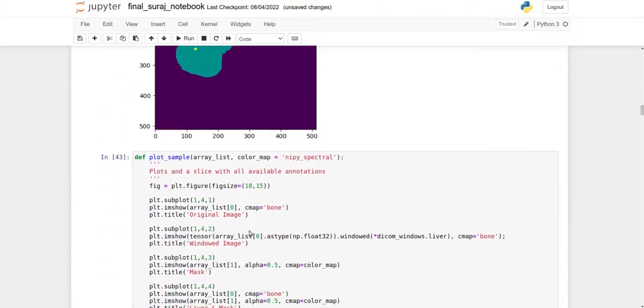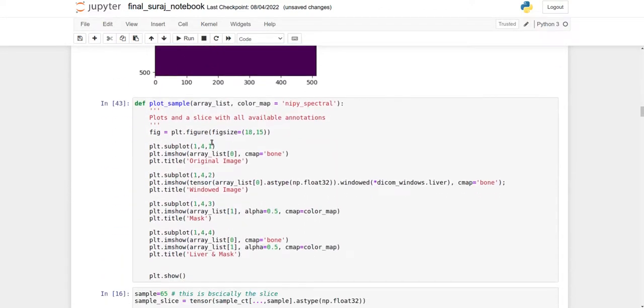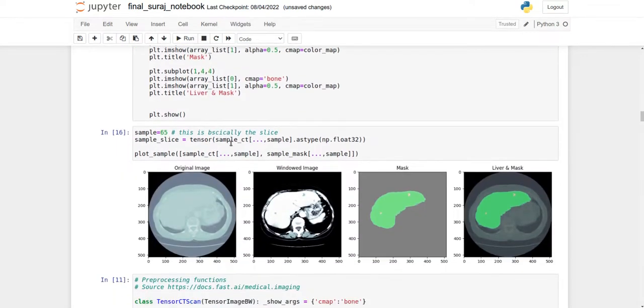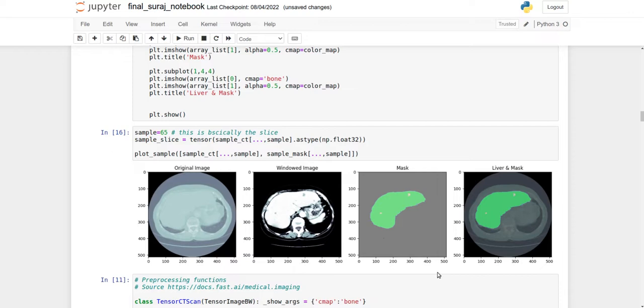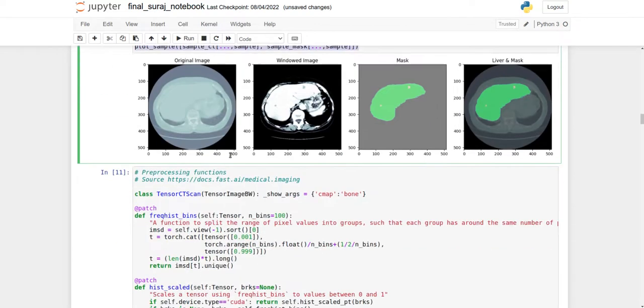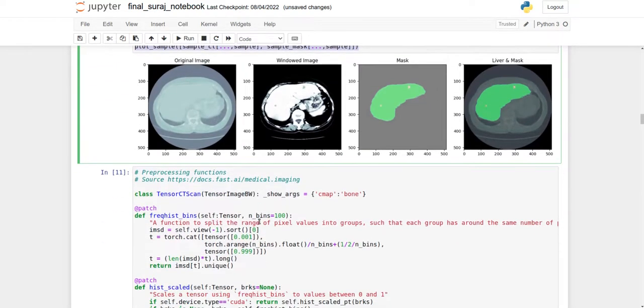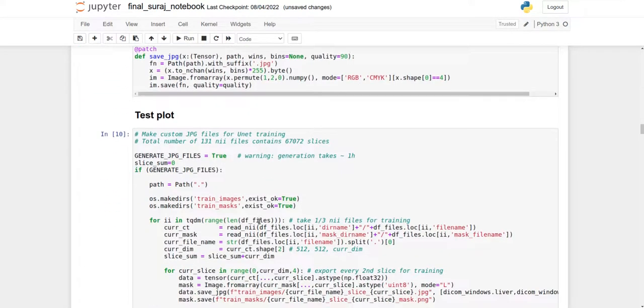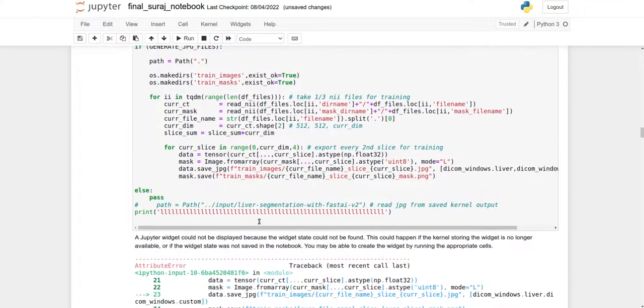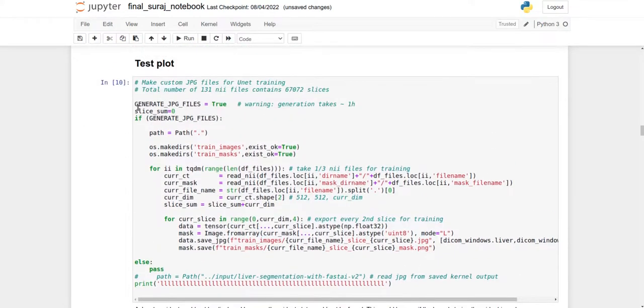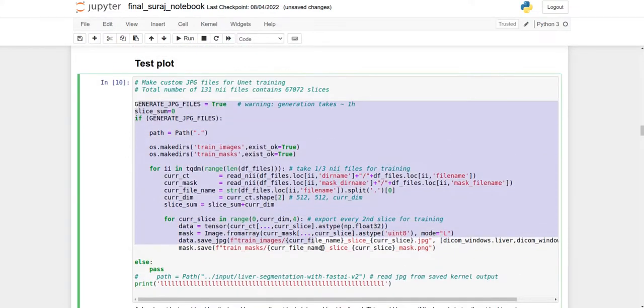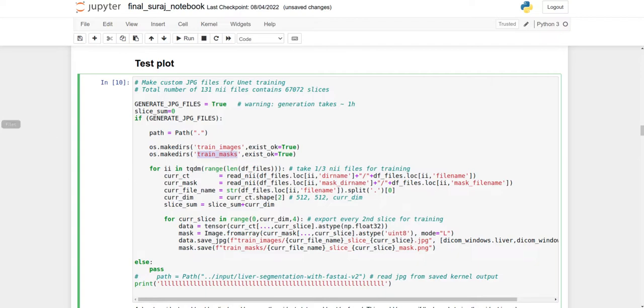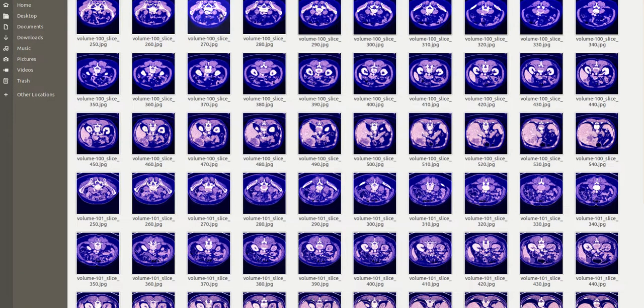This is the liver segmented image where these dots represent the tumor in the liver. This custom function enables us to see everything in one image using subplot: original image, windowed image, mask, and liver mask. Then we move toward saving the images using this method.